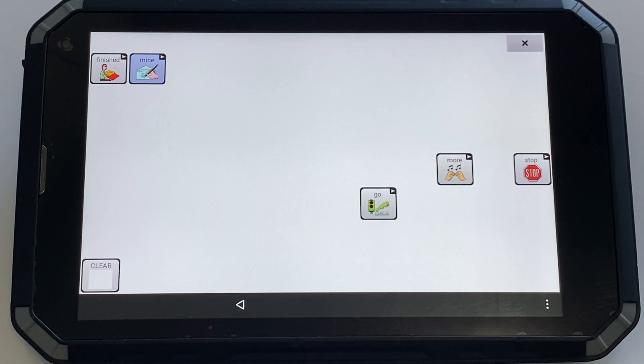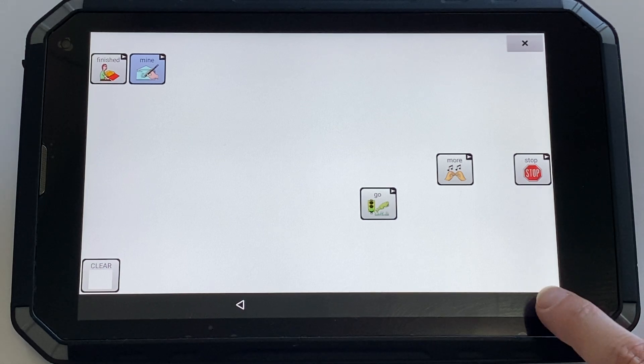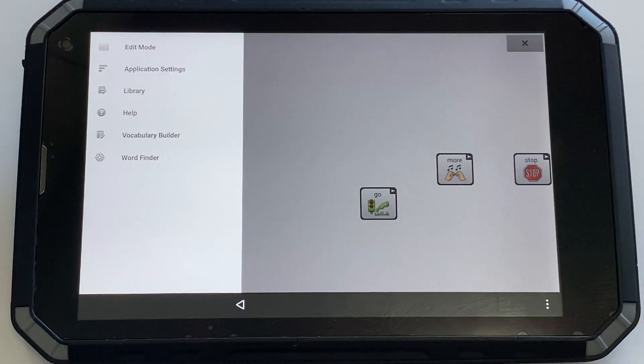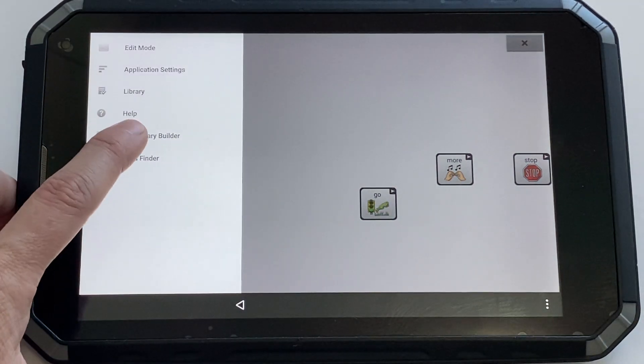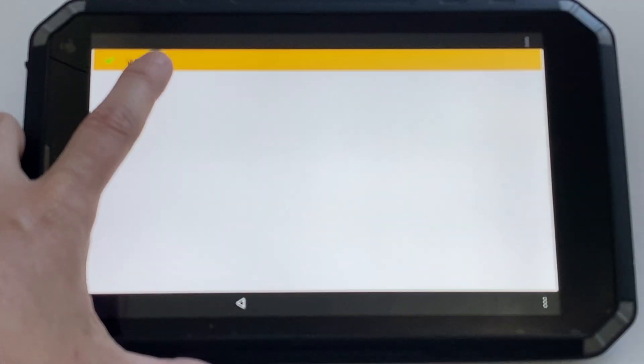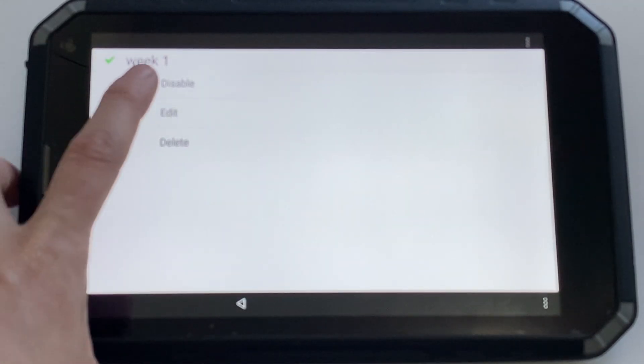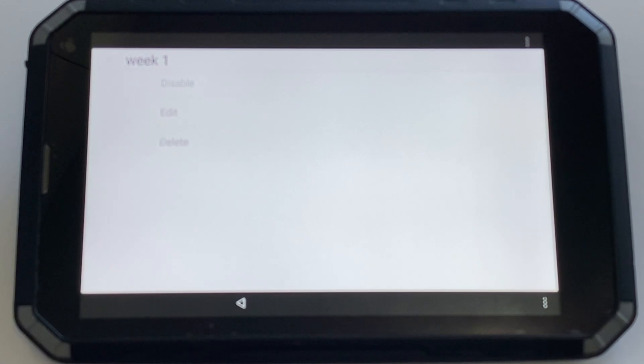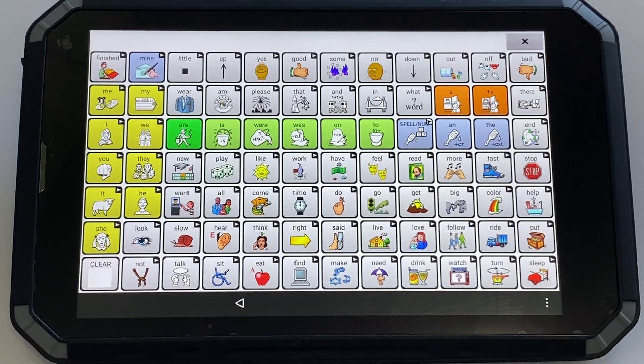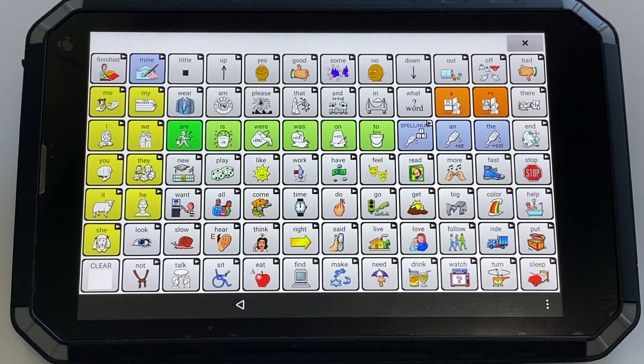If you want to get your full vocabulary back, click the three dots, then Vocabulary Builder. Tap the list that's been enabled by holding and then select disable. Choose your back arrow and you can see you're back to your full vocabulary.